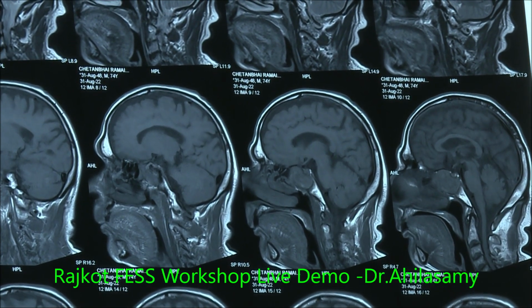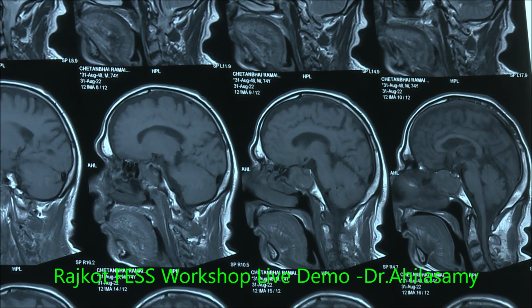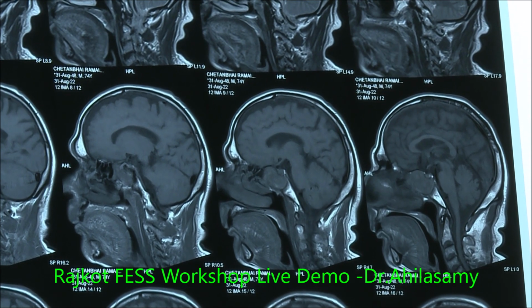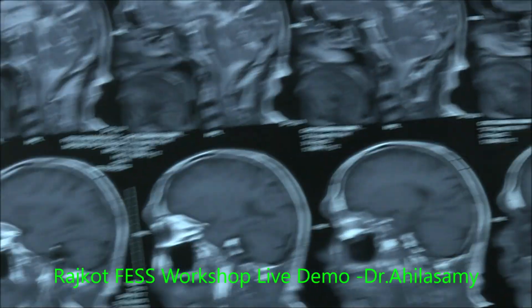Let's see. If it's a tumor, I will take a biopsy and come out. If it is fungal, I will take it out. Let's go to the CT. This is the CT coronal.